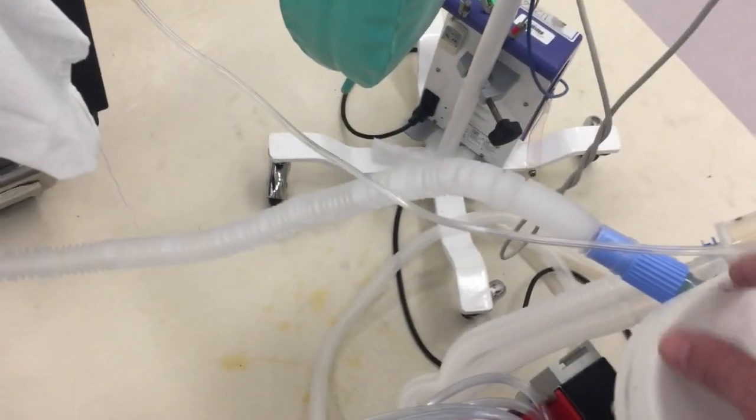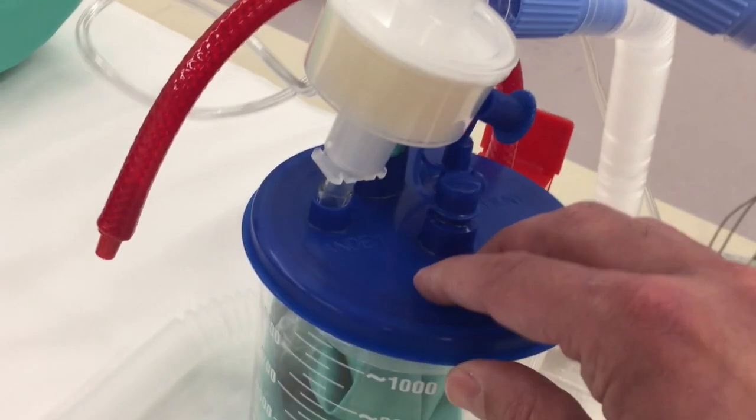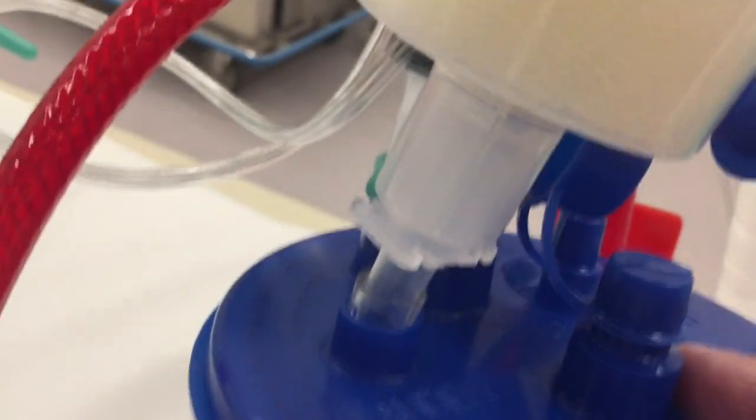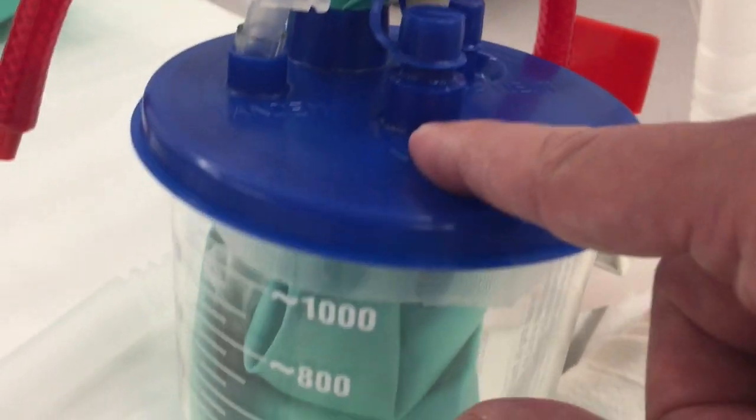The way it works is we have the inhalational limb of the ventilator hooked up to this suction canister, and it's pressurizing the suction canister. We hooked it up using one of the smaller openings with an endotracheal tube — as you can see, we cut it off and just stuck an endotracheal tube in there, and this is sealed.